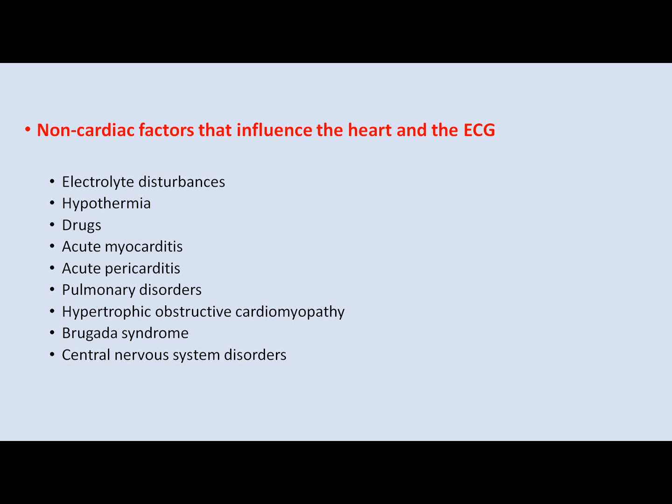Shortness of breath. I said, they have done everything. I said, thrombolysis. He's asking me why. I said, I think she has a PE. And so he said, nothing to lose. He gave thrombolytics. She had a blood pressure. She was transferred by helicopter. But you see, looking at the ECG, sometimes there are suspicions to indicate a PE.